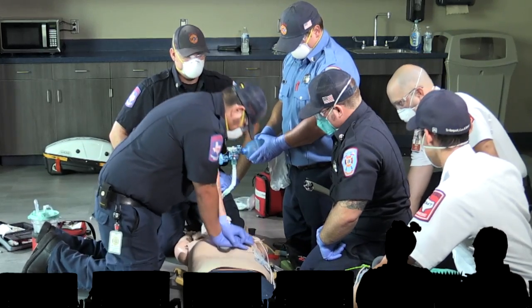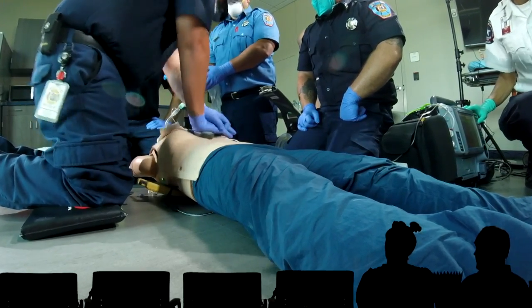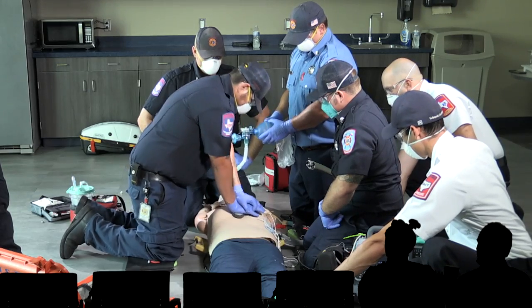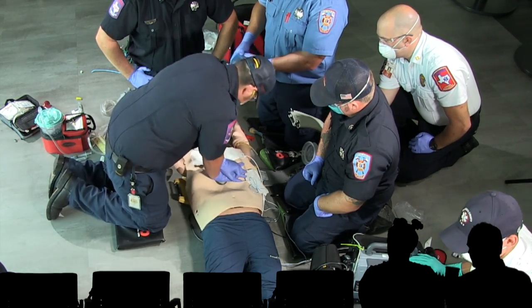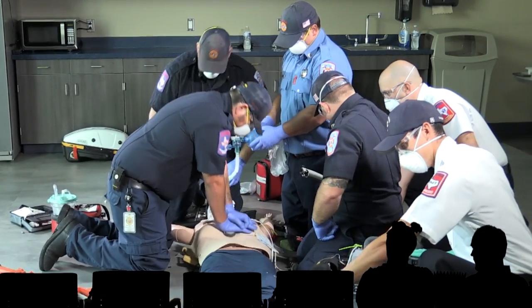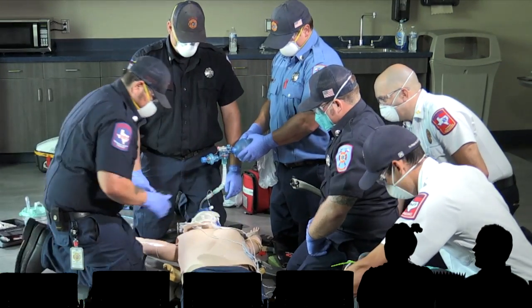Our commander already has one part of the Lucas device attached. He's supposed to slap it in at the next rhythm check. Man, I like this CPR — they're staying on it. This is what matters: good compressions and defibrillation. I haven't seen any interruption. The drama is building. Can you feel it? It's like a little tingly and it's making my hair stand up.